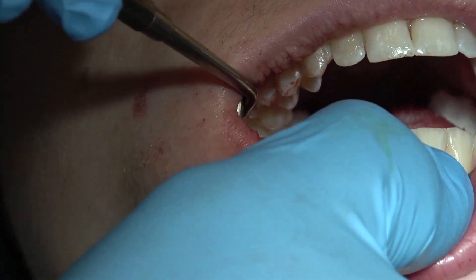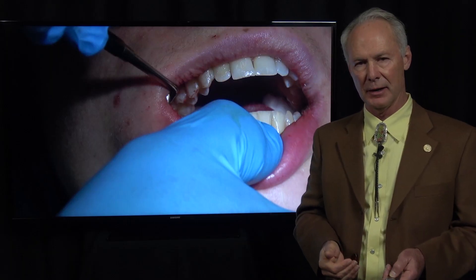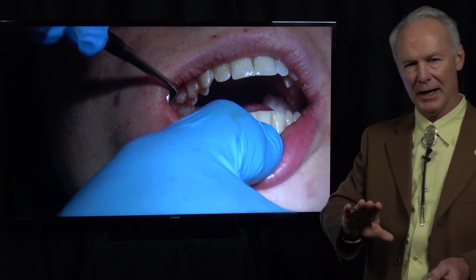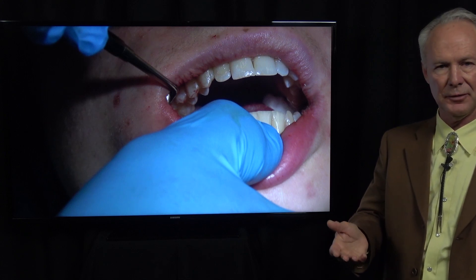Have the patient bite down on two folded two-by-two squares on each side and give nice tight pressure. Post-op instructions: have them go home — they've been sedated — and lay down with their head elevated, because if there's any bleeding you don't want it going to the back of the mouth. Change the gauze about every 45 minutes. Since we've sutured it tight, they really shouldn't have much bleeding. Be sure you suture it nice and tight. They'll probably change gauze two to three times.